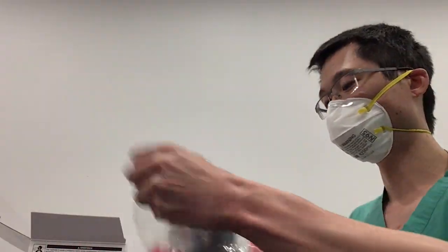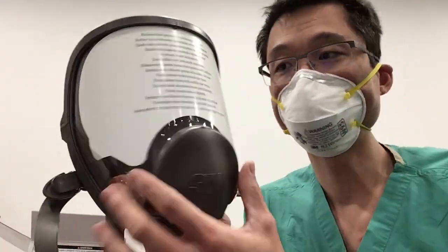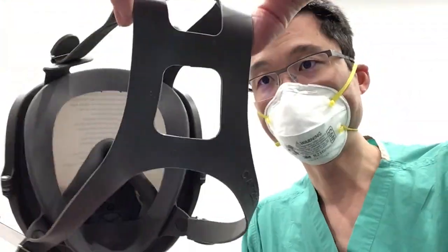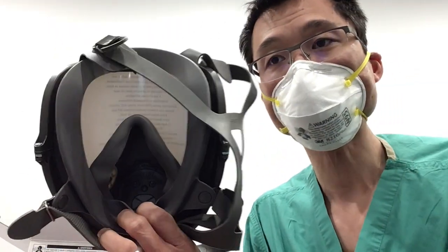Here's the mask coming out of the box. You can see it has an exhalation port and two inhalation ports. There's a nice face shield, it's covered a little bit right now, and in the back you can see there are some straps. This is the view of the mouthpiece — you can see the inhalation and exhalation valves. Overall the silicone is very soft.